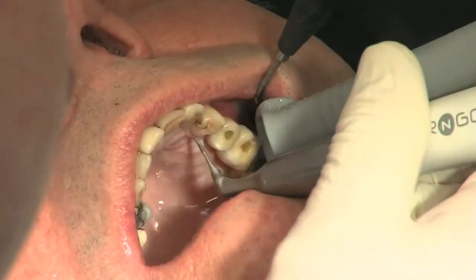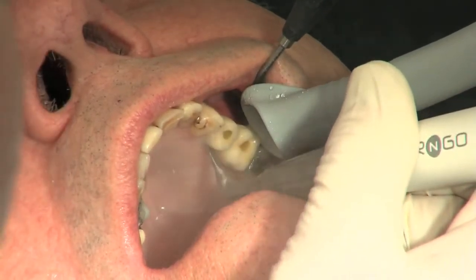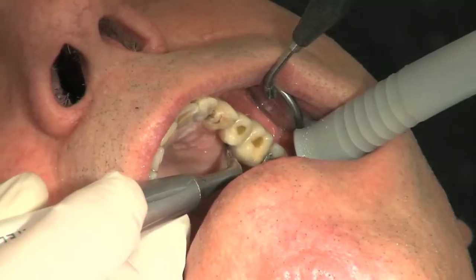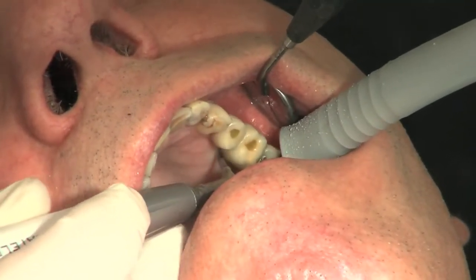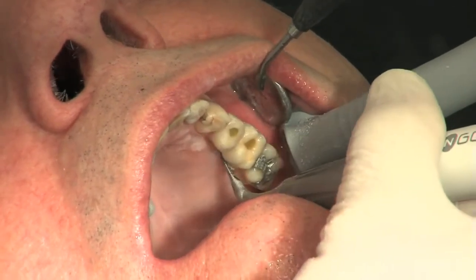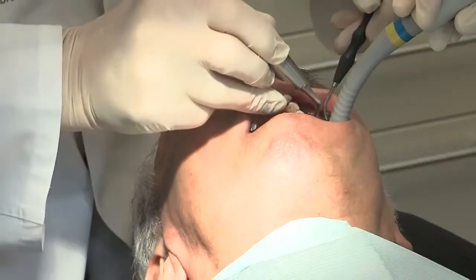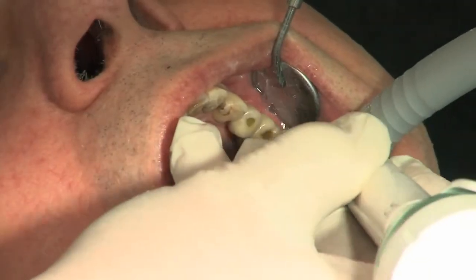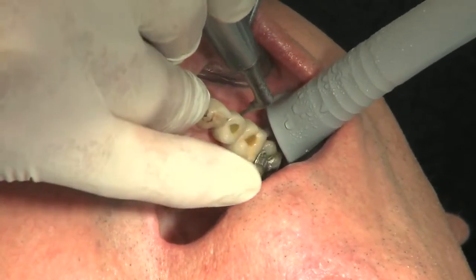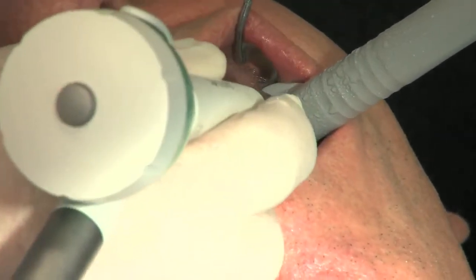I turn the instrument out to aid the instrument — much better here in this situation palatinally. I turn it backwards now and go to the next implant. Moving to the other side from the back. So now this is number 2-5, and now I go to implant 2-4.